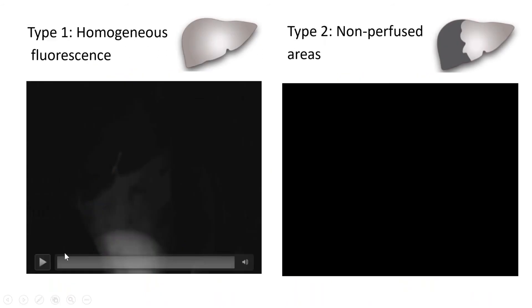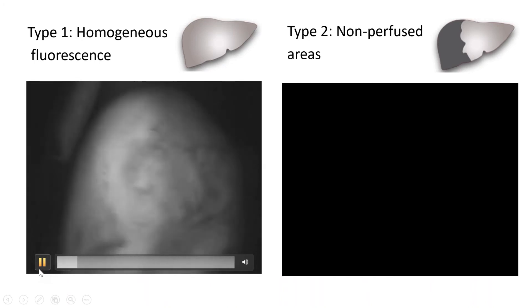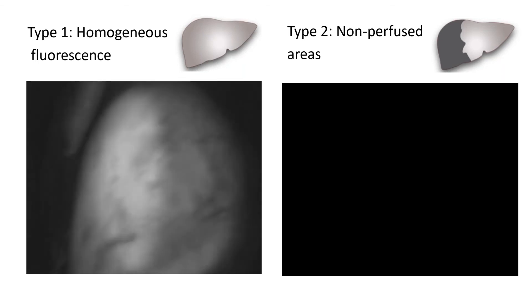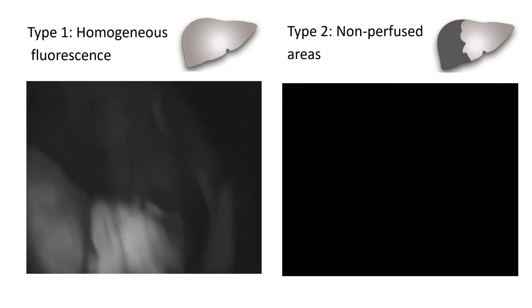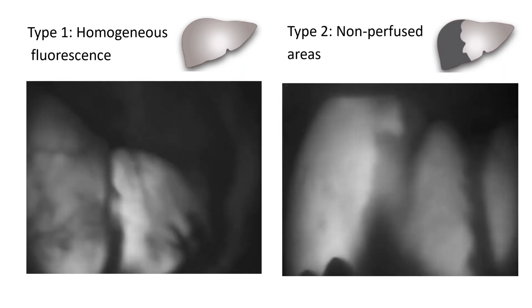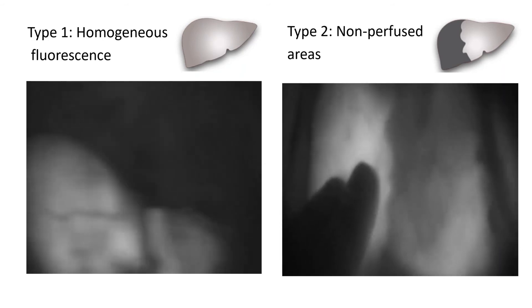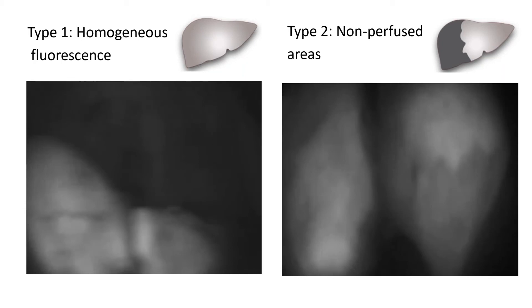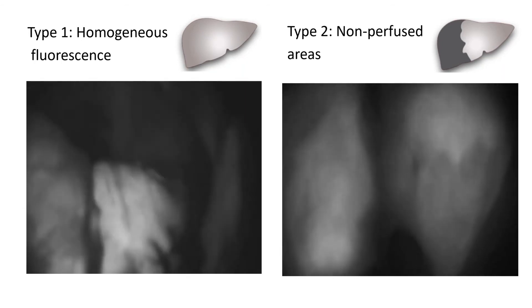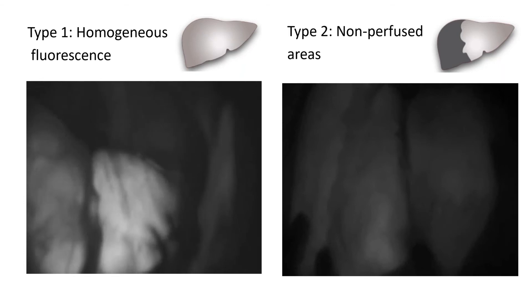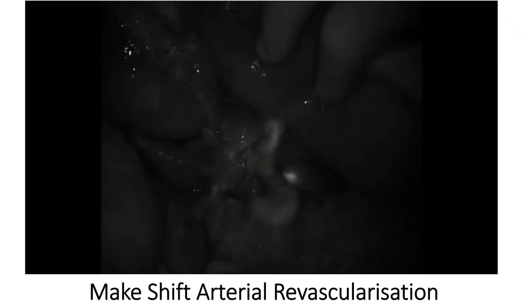This is the result of the qualitative period. In a normal fluorescence, you see the graft is totally homogeneous with no difference between the right and left parts. In contrast, in this video at the opposite extreme, there is a clear demarcation between the left and right parts, with obviously more fluorescence on the right. This can be associated with a vascular problem — either an outflow block or portal vein obstruction or thrombus — requiring urgent check of the portal vein and portal trunk.